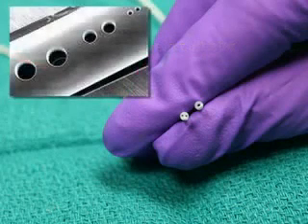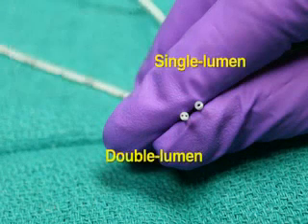Consider using a venous catheter with side holes when the catheter will be used for exchange transfusion. Otherwise, venous catheters can be single or double lumen and should have one hole.